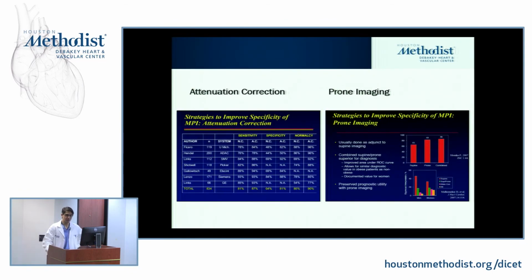These are just 2 slides showing you the data behind attenuation correction and prone imaging. You know, I won't belabor the point. I think you guys get it. Sensitivity is unchanged. Specificity only improves if you're doing these 2 things.